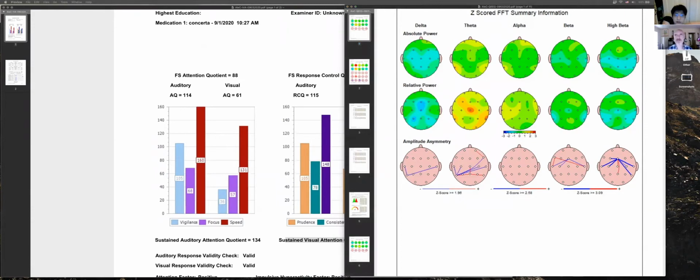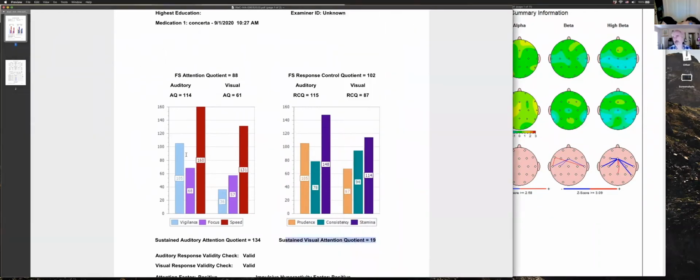Do those vary a lot by person? Well, you're seeing how much it varies per person, because the average person, if you could average a bunch of people together, it's all 100 points everywhere. Yeah, it probably varies a lot. It's 100 points for the average person, and each person has individual challenges.